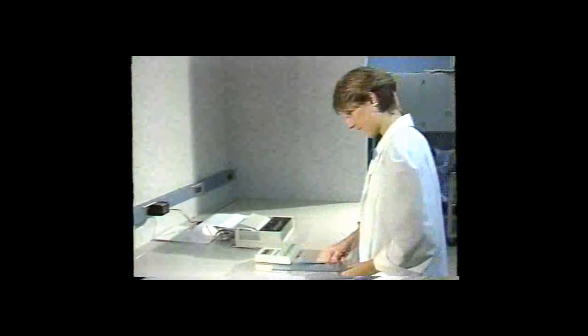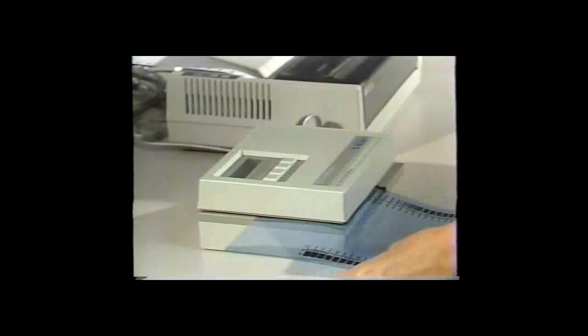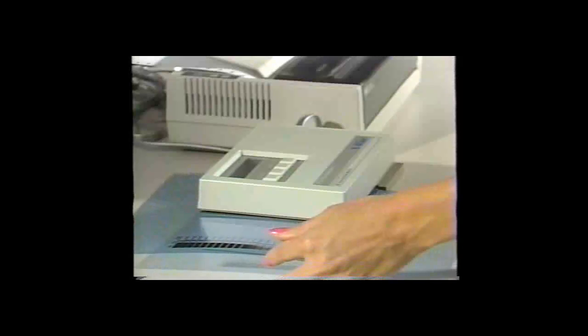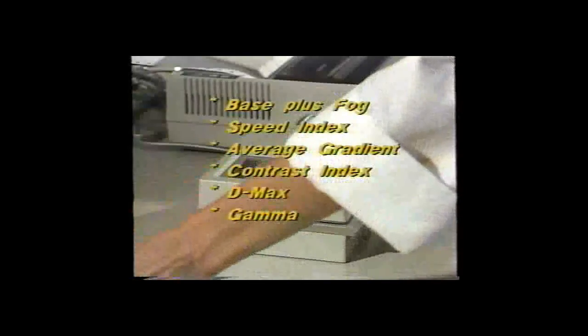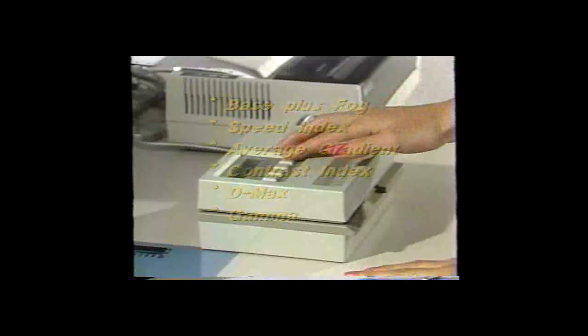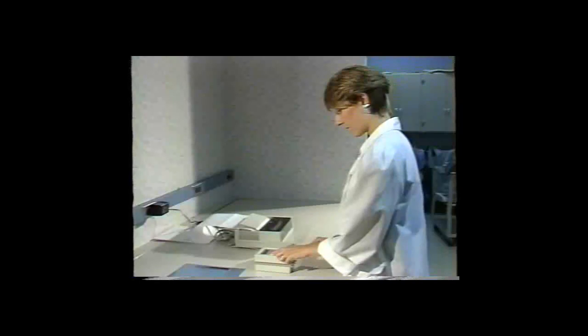The X-Rite 381 densitometer has been designed to automate the traditional procedure. It reads all 21 steps on the sensitometric strip, stores the data, and calculates each film parameter — including base plus fog, speed index, average gradient, contrast index, Dmax, and gamma. All this happens in the same time required to make just one reading with a manual densitometer.